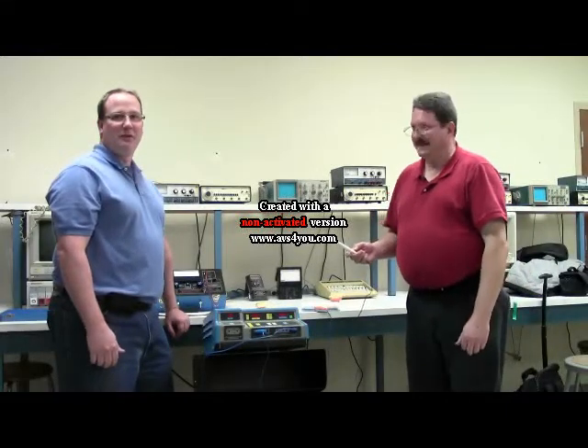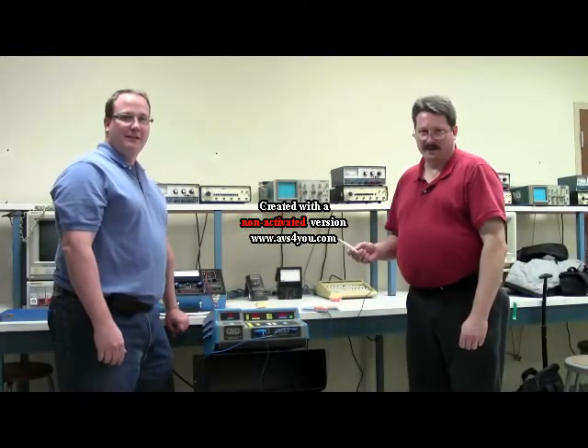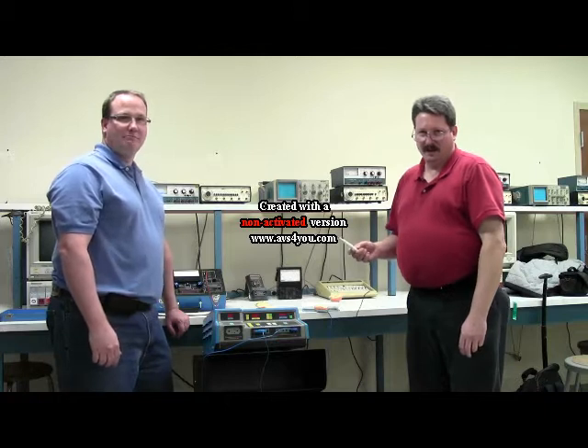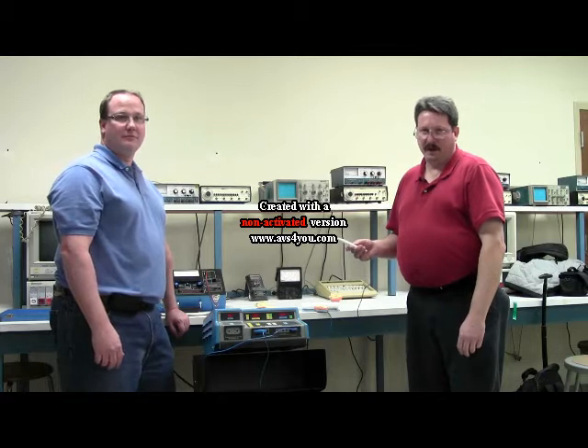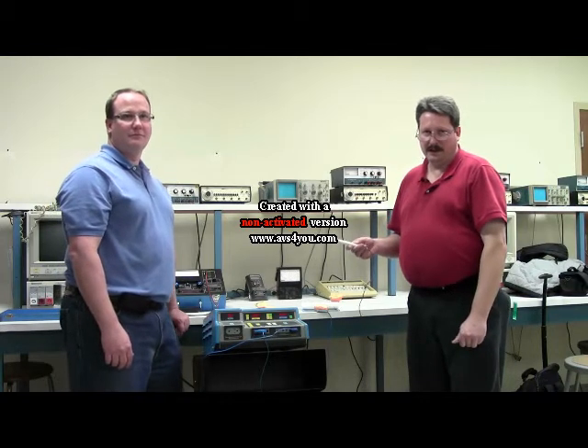My name is Darren Bogan. I'm Ted Colby. And we're Cincinnati State students doing a final project for Steve Gelton's Biomedical Instrumentation 3 class.